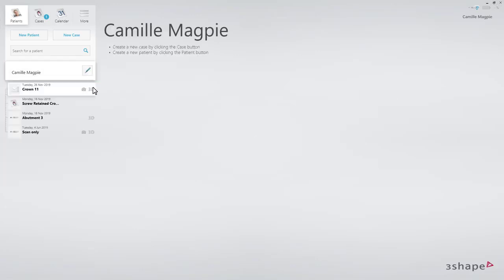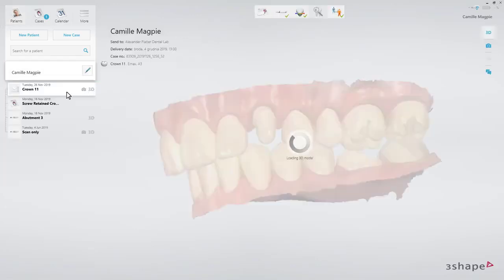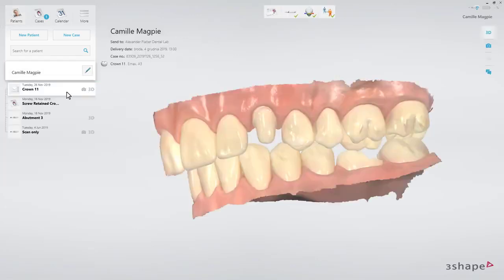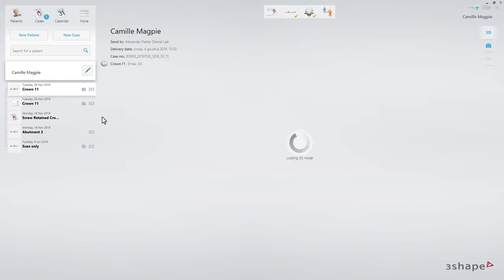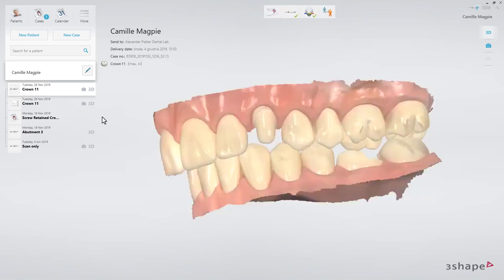Start with a case that has already been sent to a lab. Firstly, right-click on the order and select Copy. The copied order will now have a scanner icon, and the send page is not marked with a green checkmark. Also, the order has a new ID, as it is in fact a new separate order.